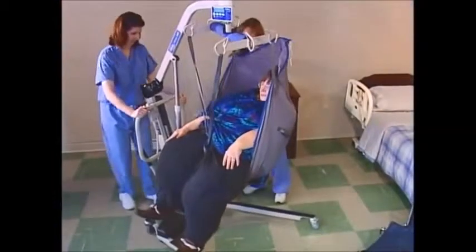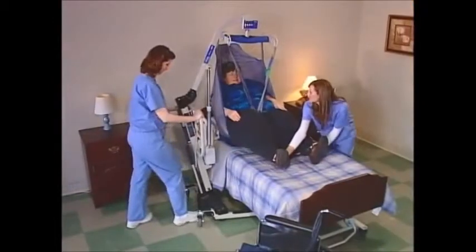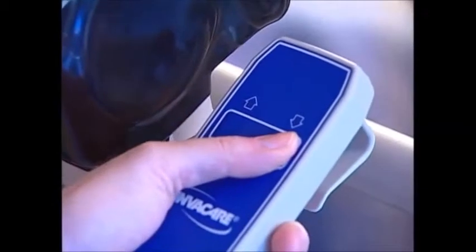Use the push handles to slowly move the resident toward the bed. Rotate and position the resident over the middle of the bed. Press the down button on the hand pendant to lower the resident onto the bed.